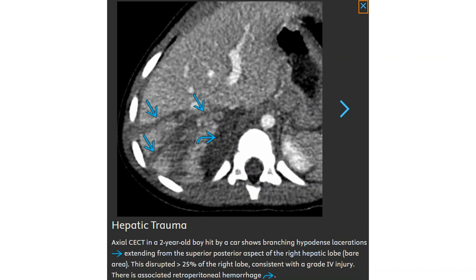Contrast-enhanced CT in a two-year-old boy shows branching hypodense lacerations extending from the superior posterior aspects of the right hepatic lobe. This disruption of more than 25% of the right lobe is consistent with a grade 4 injury, associated with retroperitoneal hemorrhage.